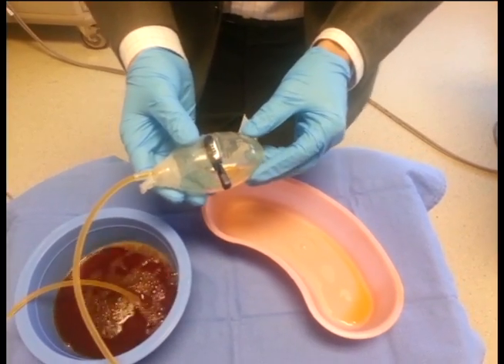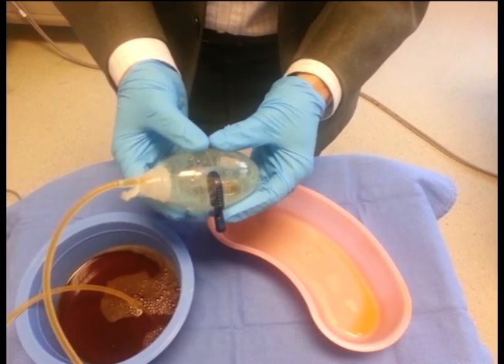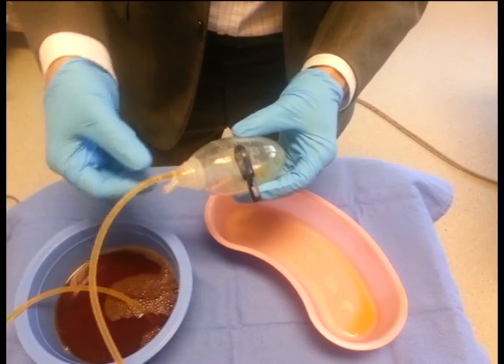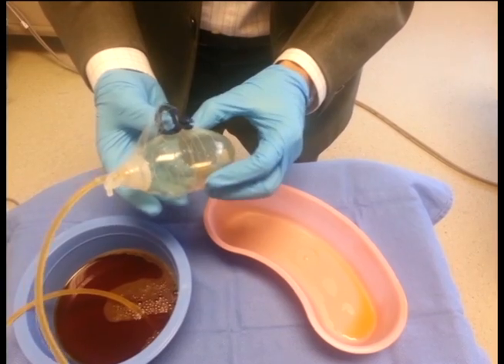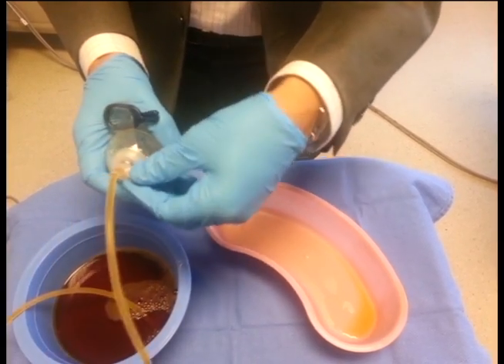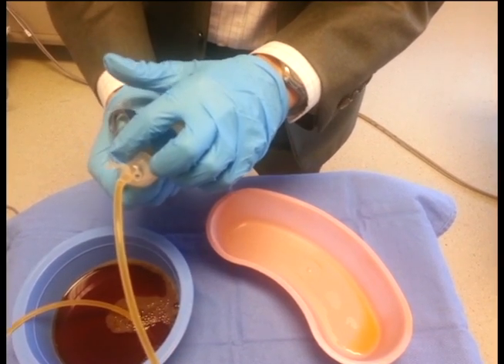This is how to use the surgical drain. This bulb will be the reservoir to collect fluid, and it takes fluid away from the surgical site through this tubing. This tubing should stay connected at all times. If the bulb is open and enlarged like this, there is no suction taking place. We remove this tab and we squeeze the bulb.